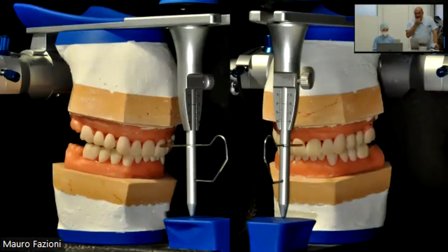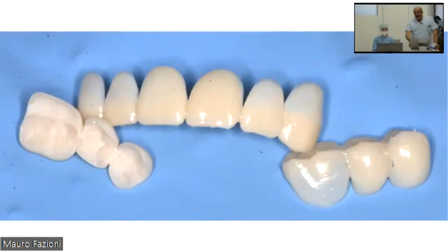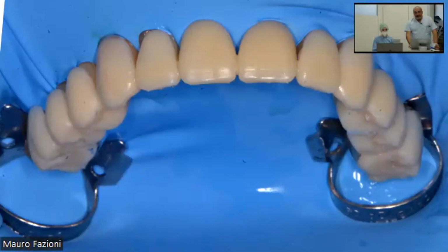Here we have printed all the shape in 3 pieces, one from the front and two from the posterior teeth, and we have set the vertical augmentation. Here is the restoration out of the printers with only a polishing approach without any paint.